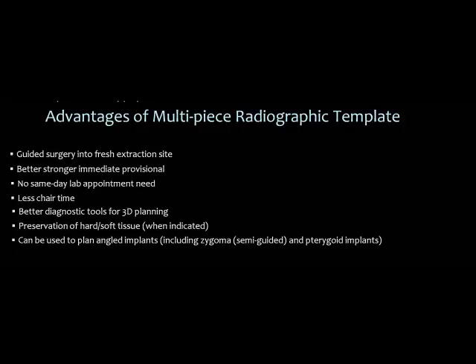Guided surgery into fresh extraction sockets. That's something that's not really been popular and something that now we can do. I think we have a better way of doing it now with guided surgery. Better, stronger, immediate load provisionals. These are provisionals that have a cast framework in them. These are not converted dentures.